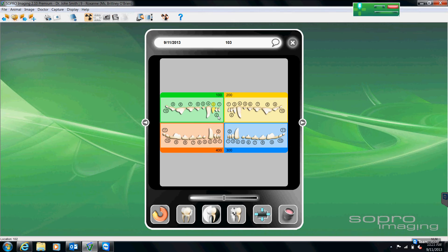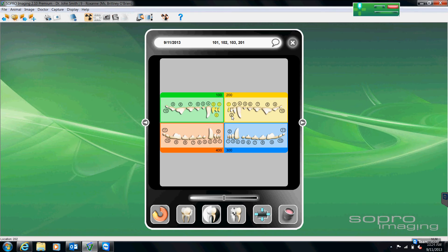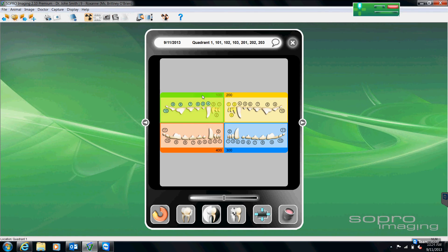Here I can just select or deselect the teeth that are in my image. If I want to go by quadrant, I can select the entire quadrant as well.